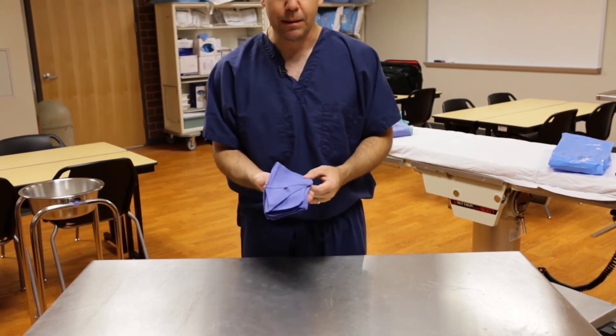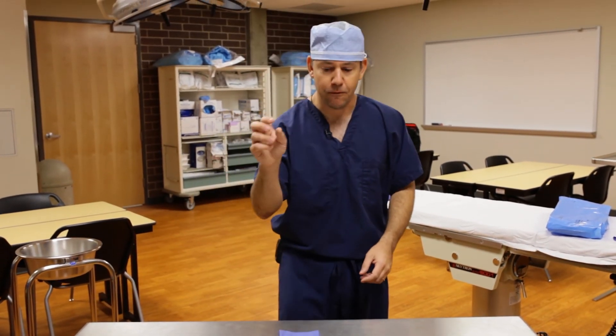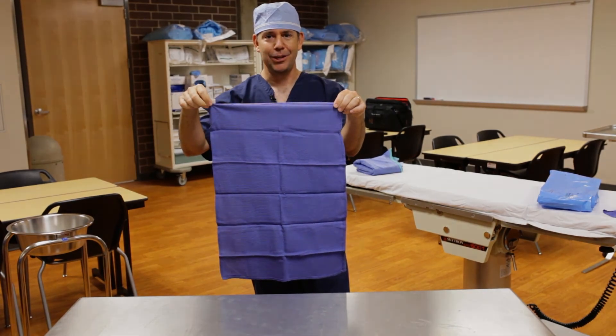And there we have a proper surgical towel folded correctly, so that when I grab it off my back table, it's going to fan fold out perfectly for me and I'll be able to dry my hands. All right, thank you.